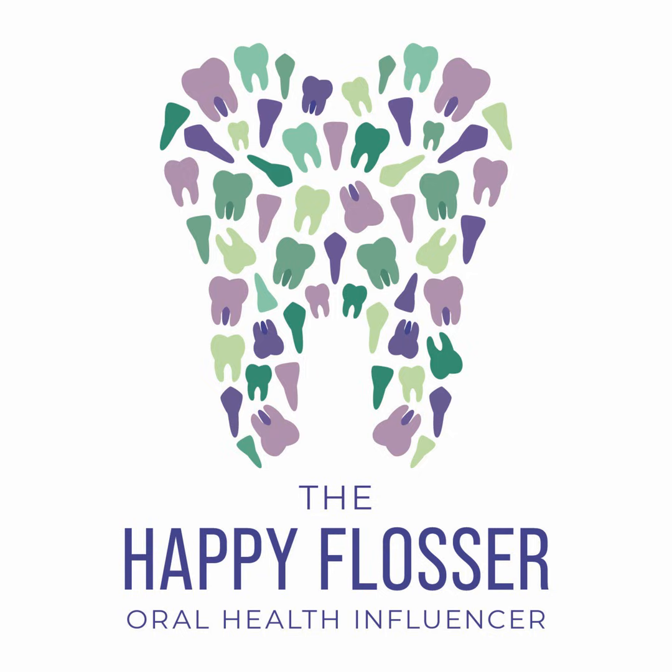And then after I've looked at the caries and I've looked at the periodontal health of the bone supporting structures, I'm going to look for pathology. Maybe there's pulpal stones or calcification or a possible abscess or some kind of cyst or granuloma or something that's present. And I know our eyes tend to go there, but the reason why you have to have a system is because you don't want to miss something because something is like a beacon staring at you. You know, if you got like a big flashy green light saying, "Hi, I'm a cyst, I'm over here," you don't want to lose sight that you need to still check and assess for things like caries, and you still want to check for periodontal issues.